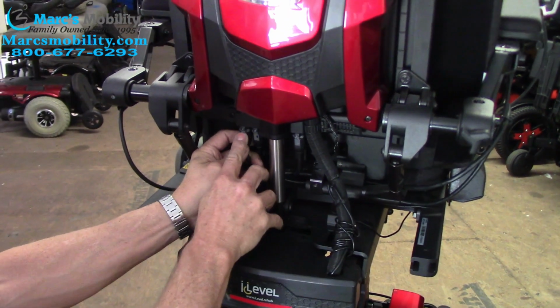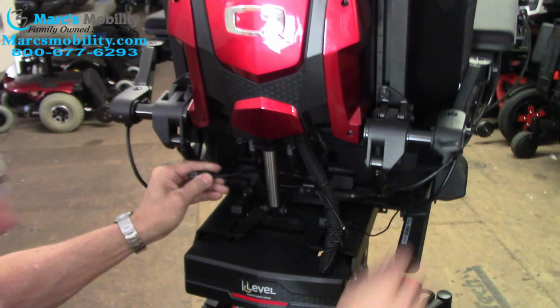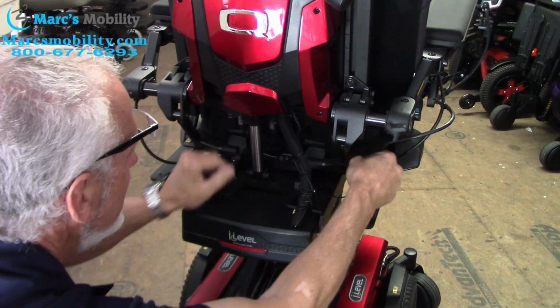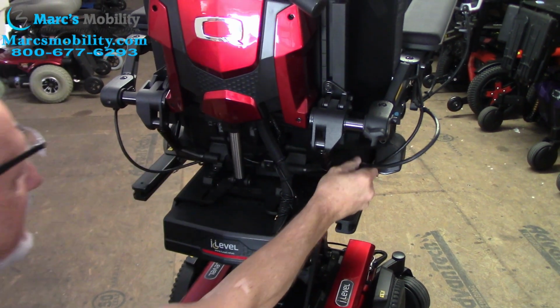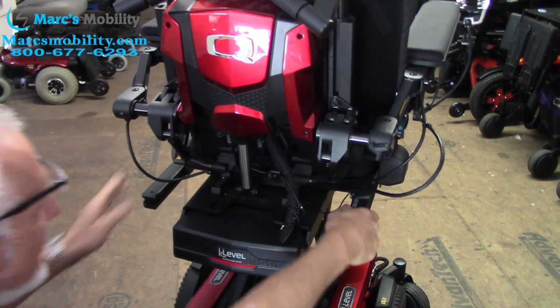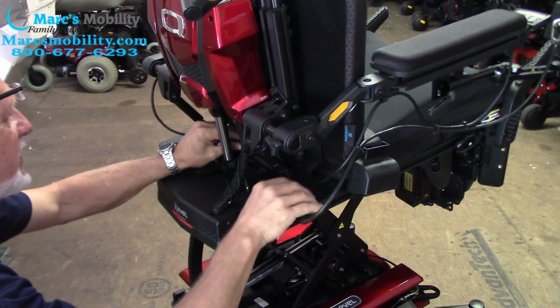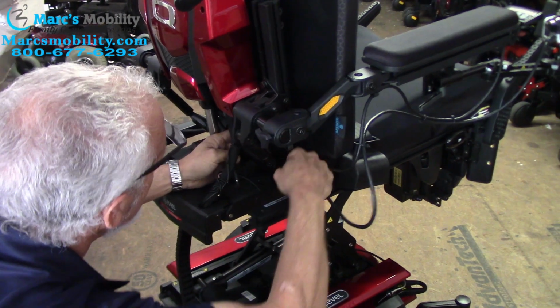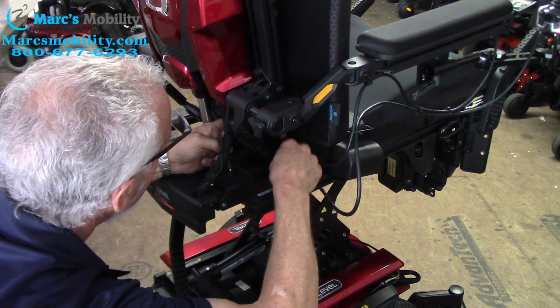So you unplug it here. You got to push the tab, unplug it, okay? And then you got to run it out, pull it, and you got to run it through that little loop, and that's going to be the hard part because there's not a lot of room to run it through there, okay? And so you have to pull it out through that little loop. There's two wires on this one. This is why it's a little bit, yours only has one wire, so that's going to be a lot easier. So you have to pull it out through that.